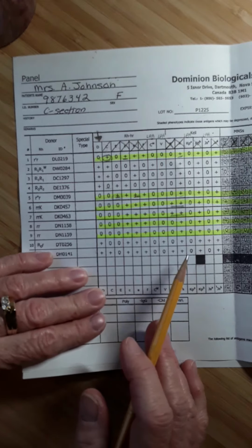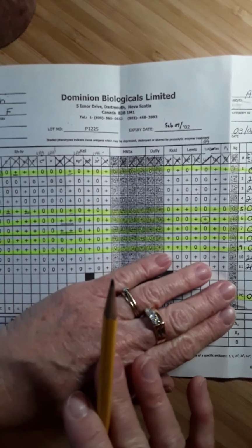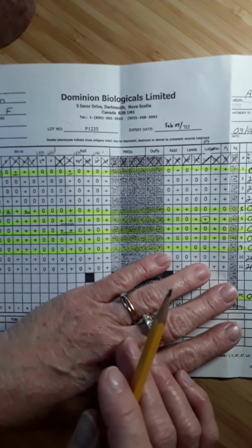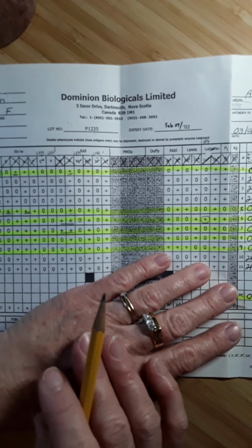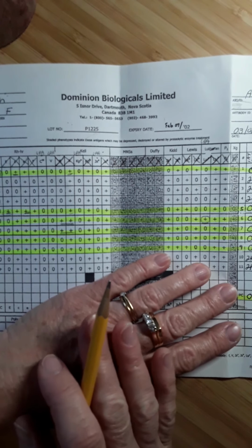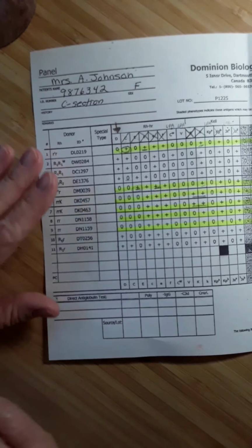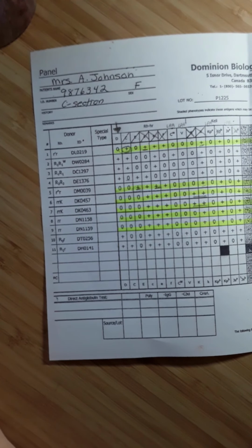If this was a pre-op collection, we would see on her type-in screen that it came down with a surgical date shown and that the patient had answered these 2 questions. Have you been pregnant or transfused in the last 3 months? Now, this patient has obviously been pregnant, so she doesn't qualify for the extended timeline on a pre-op type-in screen. So her type-in screen outdates in 96 hours from collection. So we can get the units of blood matched for her, and that way when they call, they can have the units up and running into her very, very quickly.